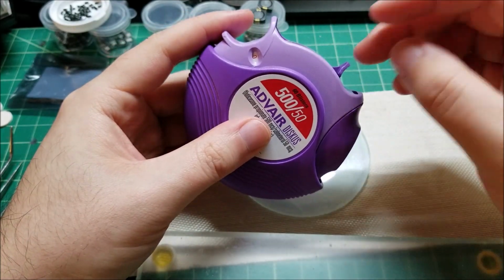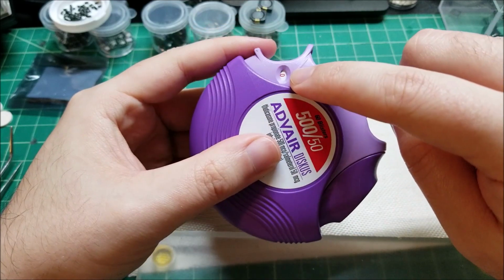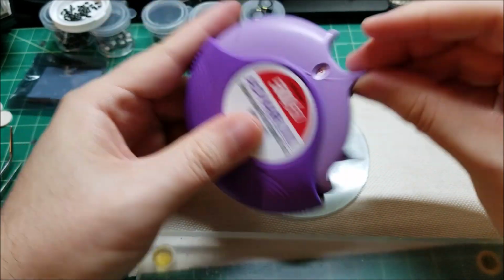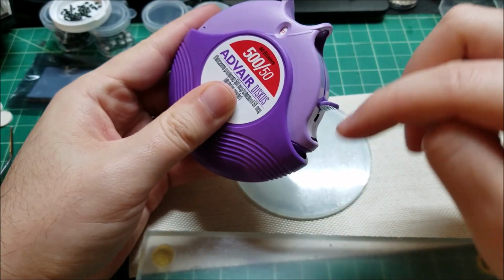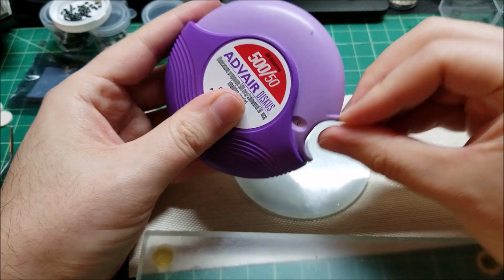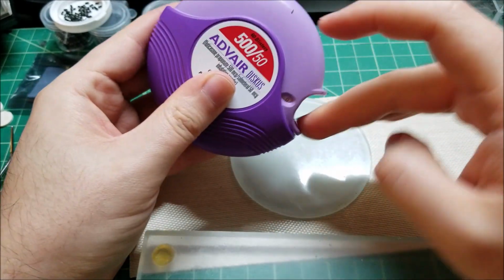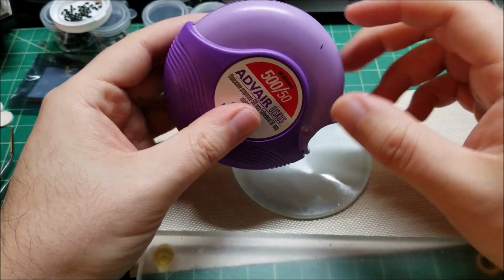I don't really know too much about it, but anyway, there's a little counter on the side here. It tells you how many doses are left in the disc, and when you reinsert it, if you cock it back like this, it reprimes it for the next dose, and it has this kind of interesting mechanism here. Because this one's spent anyway, I thought we would pop this open.